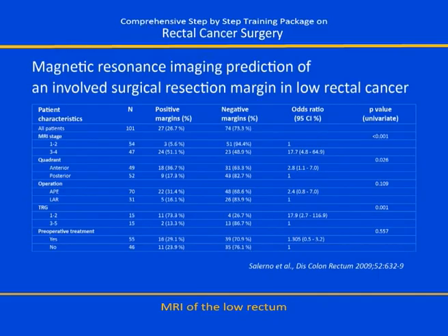So when we look at the ability of imaging to determine those patients with positive or negative margins, this staging system actually supersedes the traditional assessment of the distance of tumour to the mesorectal fascia, and by adopting this system and identifying the stage 1 and 2 versus 3 and 4, what we then find is that we have picked up the majority of patients with a positive margin.